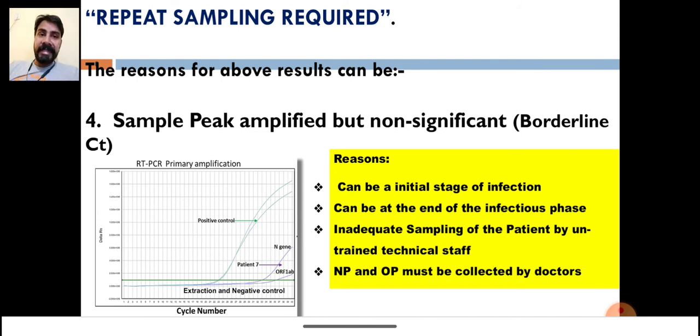For example, the cutoff CT for reporting a positive result currently—the guideline says less than 35 will be declared as positive. So tell me, if I get a sample with CT 35.5, what will I do?